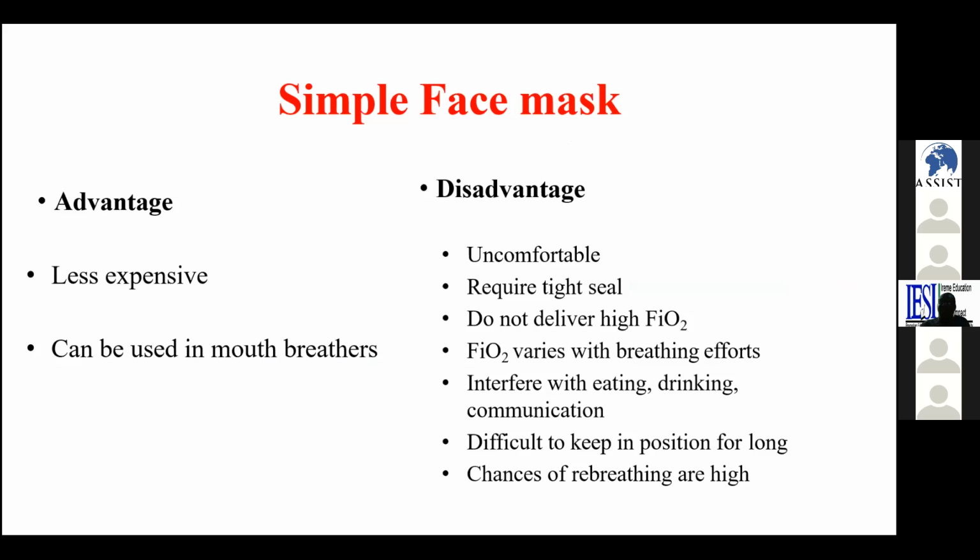It can't deliver high FiO2, and the FiO2 will vary depending on the patient's respiratory effort. It's not easy to eat, drink, or communicate with a simple facial mask, and it's really difficult to keep it on for long periods. Let's go to the next slide, please.